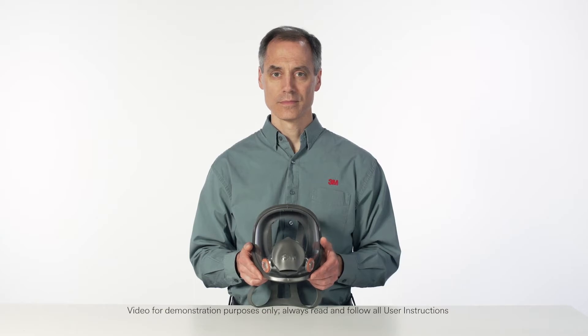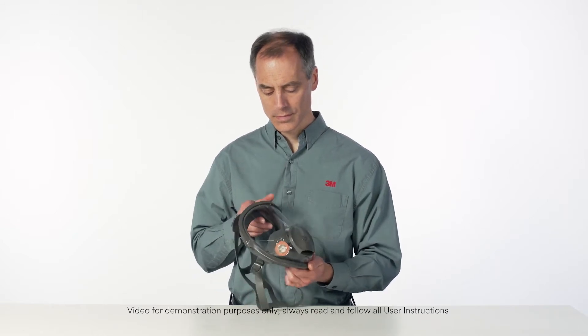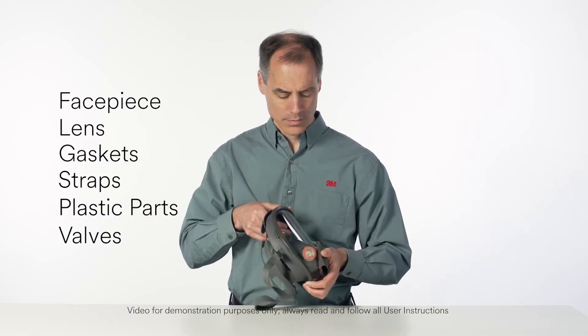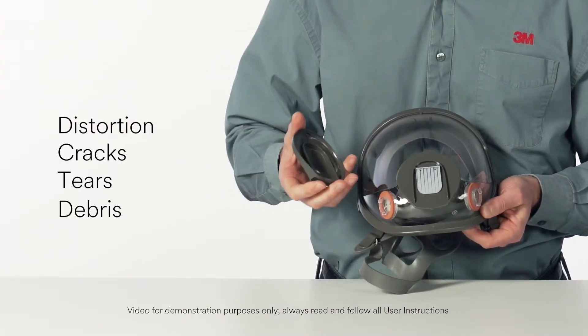Before each use of your Full Facepiece Respirator, inspect it for any signs of damage. Check the facepiece, lens, gaskets, straps, and all plastic parts and valves for distortion, cracks, tears, and debris.